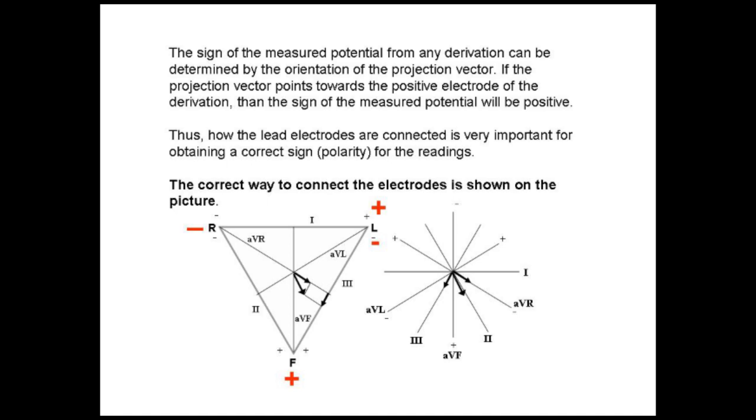So let's combine these two pieces of information together and see what kind of potentials we are going to measure from the three basic derivations.